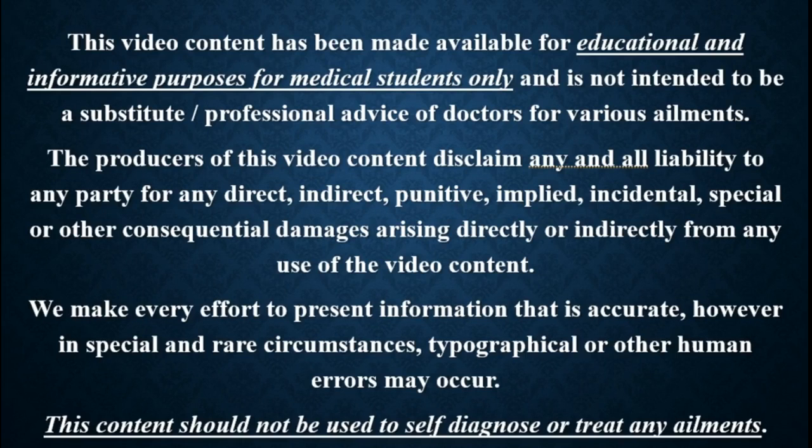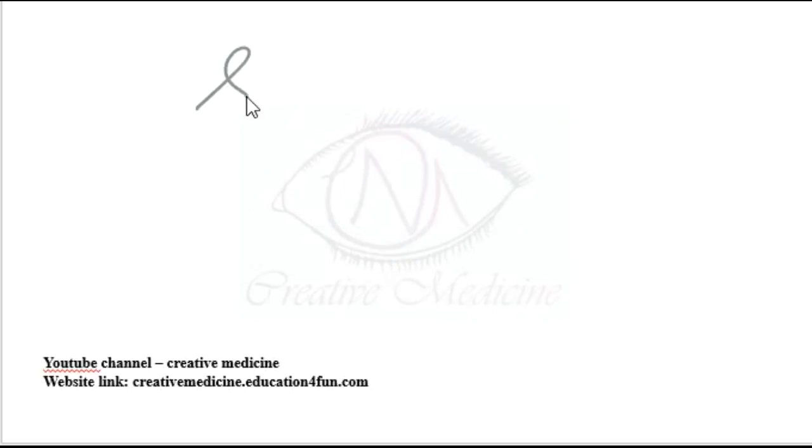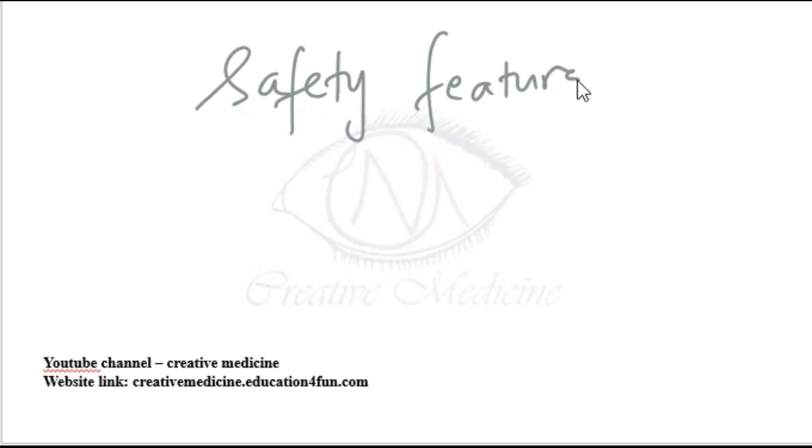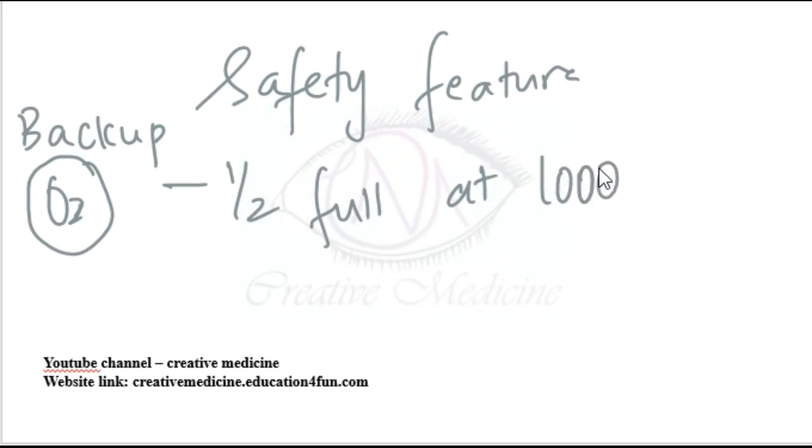In this lecture, we will learn about safety features of machines and circuit. Backup cylinder contains oxygen, and the backup cylinder should have half of full oxygen. That is, backup cylinder should contain oxygen at 1000 pound per square inch.